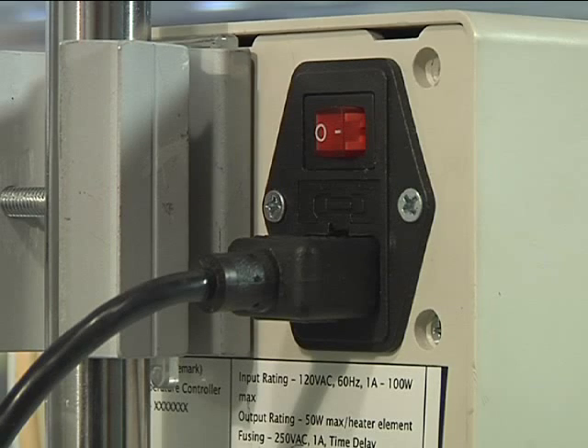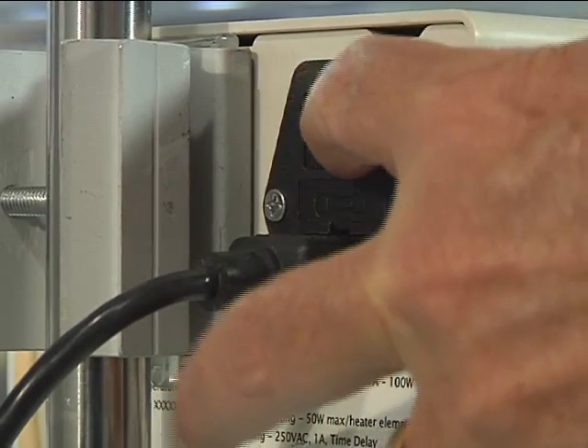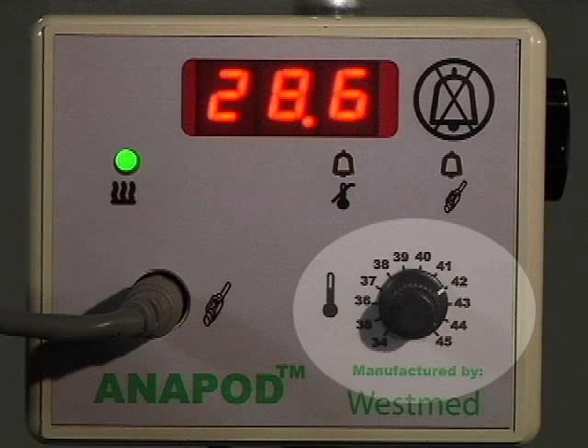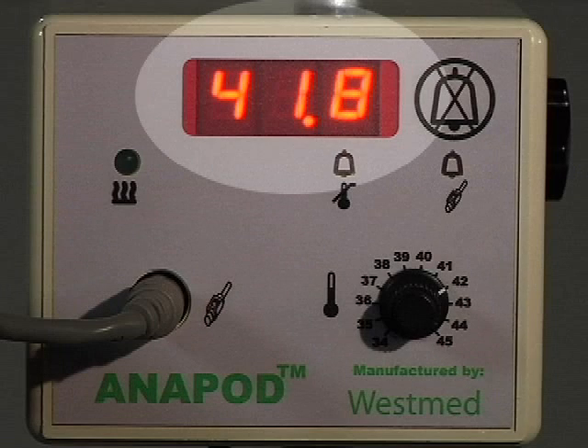Turn the on/off control switch on the rear of the Anapod humidification system to the on position. Set the temperature control to the desired temperature between 34 and 45 degrees centigrade. Set the gas flow to the desired settings. Ensure the desired temperature setting in the heated wick circuit is reached before connecting the circuit to the patient airway, and confirm visually on the front panel display.